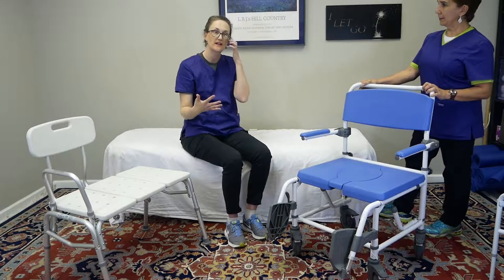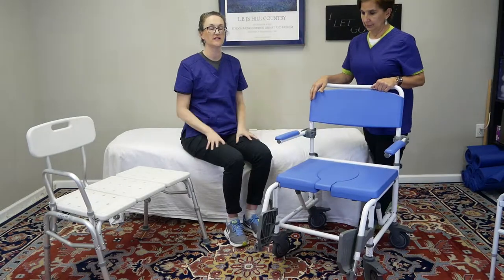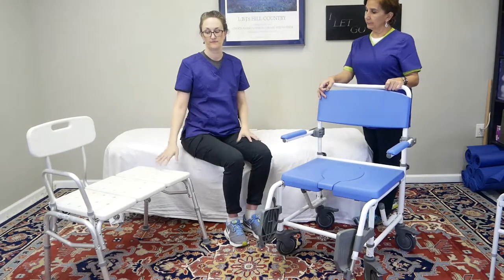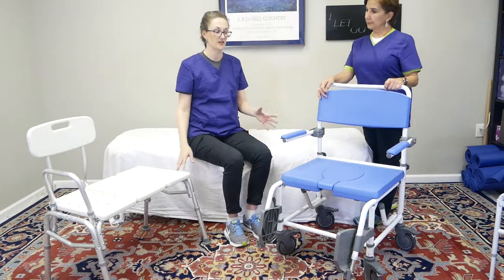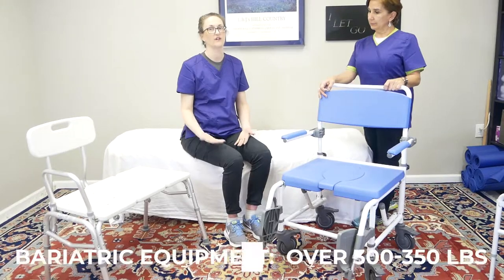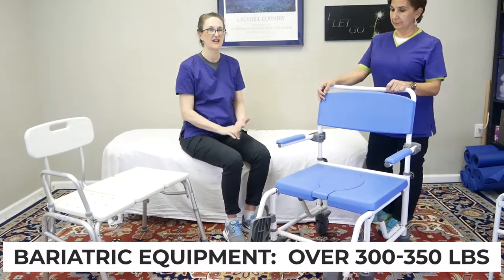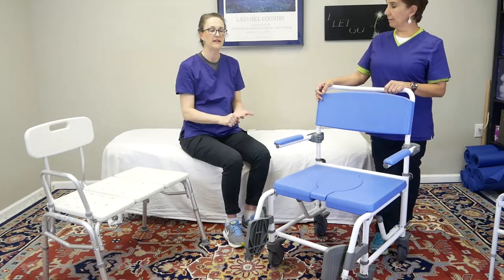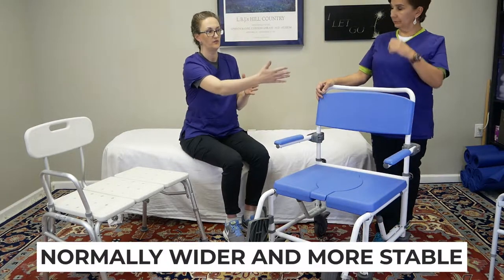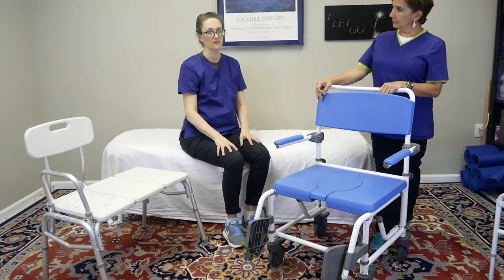One of the things we may not have mentioned — because you've heard us talk about different heights of people and adjusting equipment that way — there's also a weight requirement for almost all of this equipment. There are standard weight ratings and then something called bariatric, which is usually for people over 300 or 350 pounds. You have to check the rating of the equipment, but normally it would be wider, easier to fit onto, and stable enough to handle the weight.